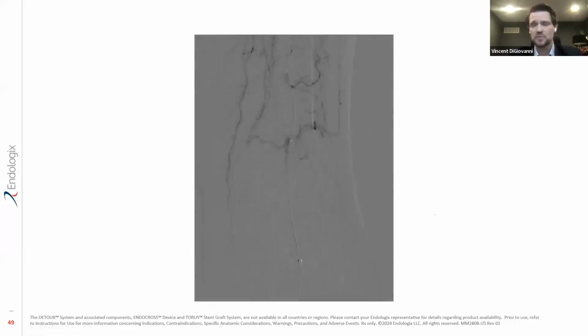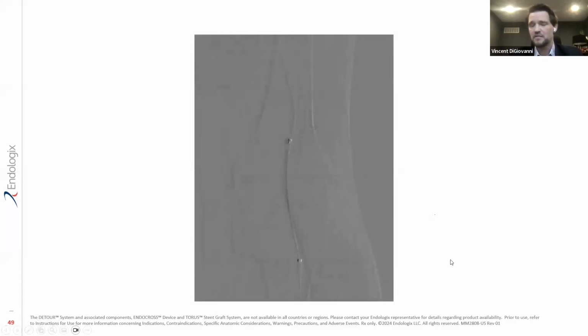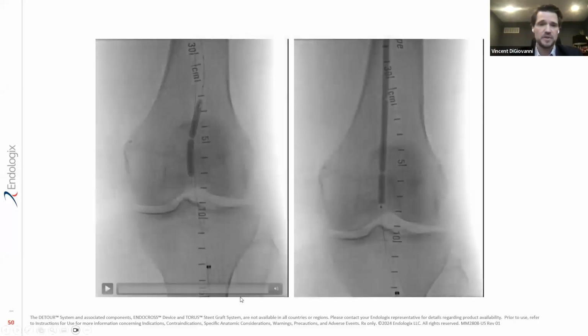Once you balloon that proximal anastomosis as aggressively as you can, and you've gotten your Endocross device down into your distal circulation, again, what we try to do is get an anterior-posterior view and line the two structures up as best we possibly can. That way, when we get our 15 millimeter throw through your Endocross device, you're hopefully shish kebabbing that vessel. And as you walk it back, as Tom mentioned, you should see that wire pass straight into that arterial system, and you should be able to advance it fairly distally without any problems.